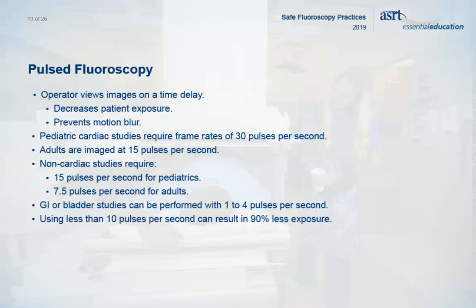Systems that can pulse the beam at less than 10 pulses per second can result in up to 90% less exposure compared with non-pulsed systems.